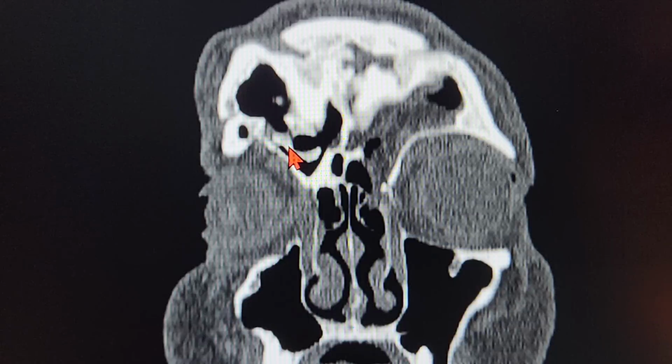It's totally a different, separate segment you can see within the sinus. This could be an abnormal bony fractured segment, which is right now seen as an isolated segment, having no attachment whatsoever to any other bony wall inside. Once we open the patient's frontal sinus from the right endonasally, we should be looking for these bony projections. We may remove them, we may drill off the excess bone to gain more access within and to see the actual CSF leak site.